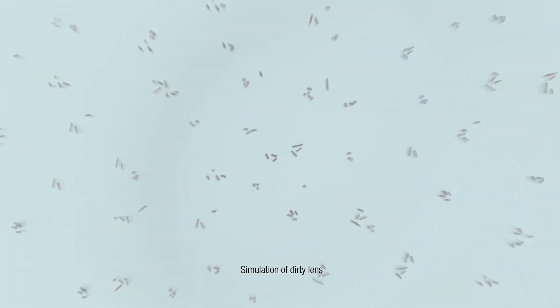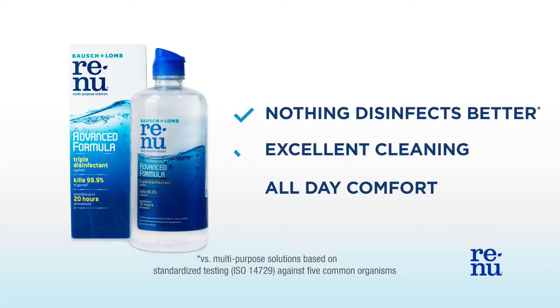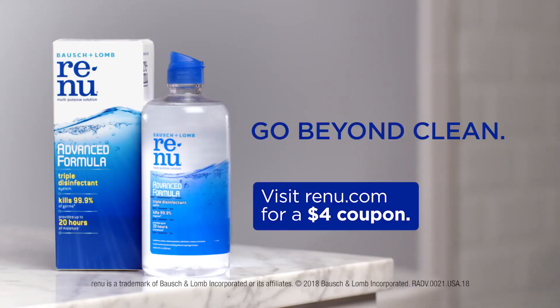Renew gently cleans my lenses to go from this to this in just four hours. Plus it's the only solution with a triple disinfectant system. Nothing disinfects better. I get clean contacts plus all-day comfort. The way I see it, go beyond clean. Renew from Bausch & Lomb.